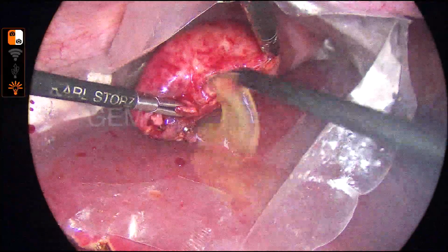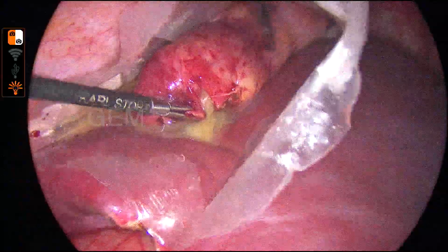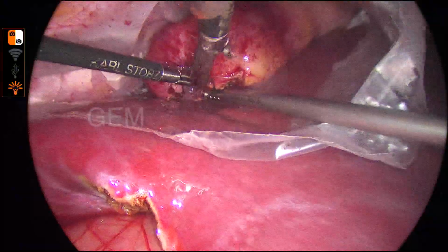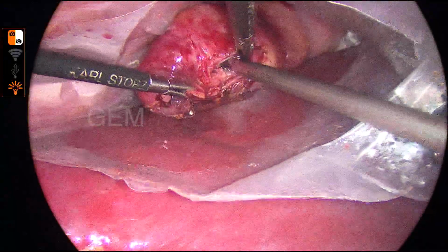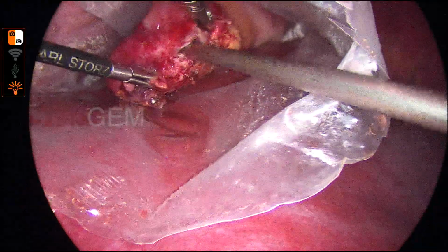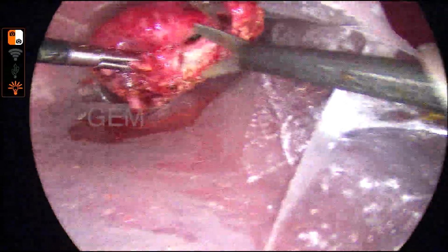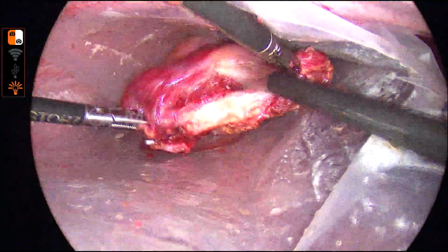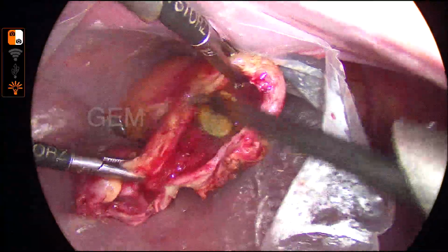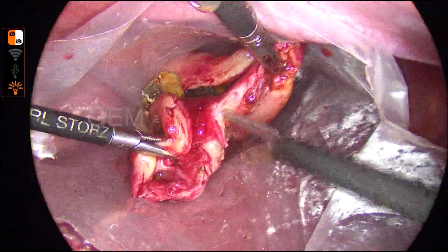Now you can see this mucocele is becoming a pyocele. It is not a clear mucocele; a pyocele is getting formed. It was a little late presentation, and you can appreciate the wall thickness. Normally it is only 1 mm, now you can see it is more than 5 mm, and you can appreciate the very large stone.